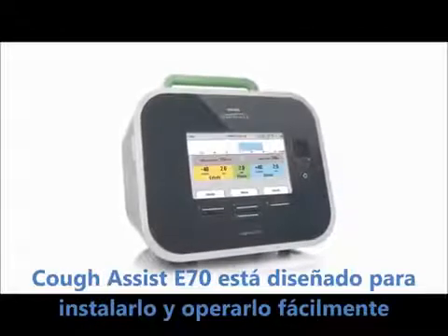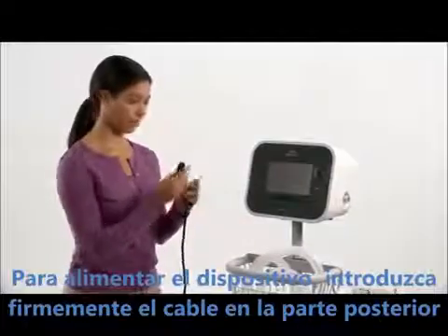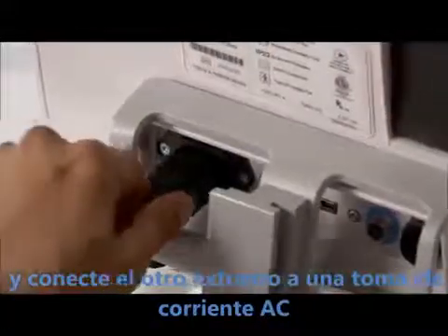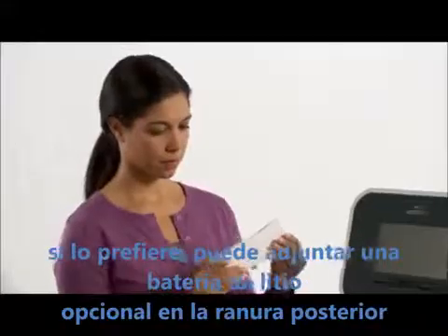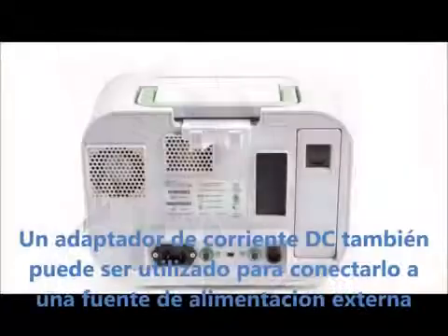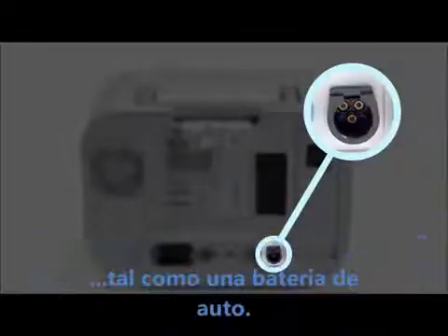CoughAssist E70 is designed to be easy to set up and operate. To power the device, press the power cord firmly into the back of the device and plug the other end into an AC outlet. If you prefer, you can attach the optional lithium ion battery into the detachable battery slot on the back of the device. A DC power adapter can also be used to connect to an external power source, such as a car battery.